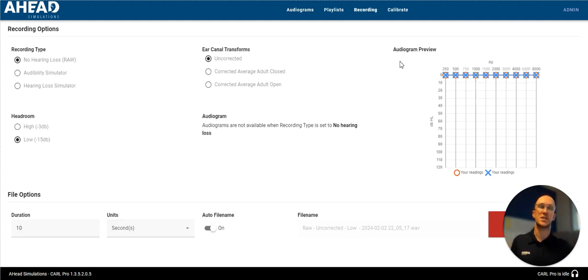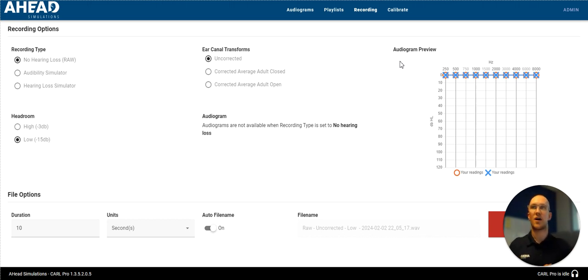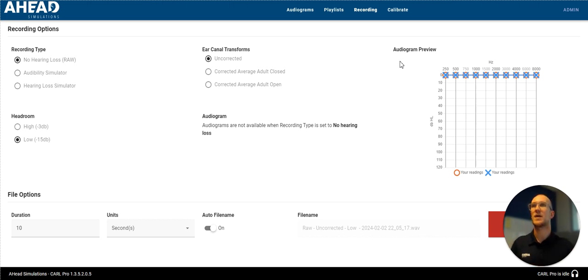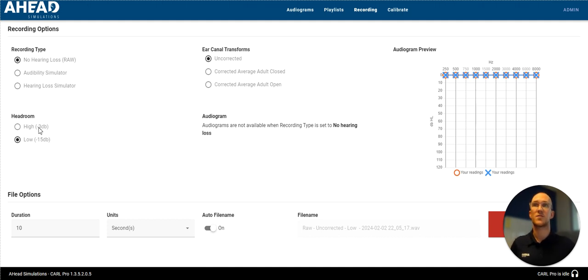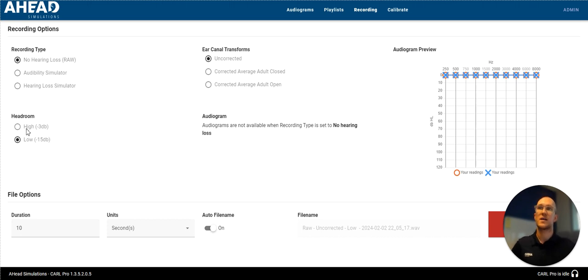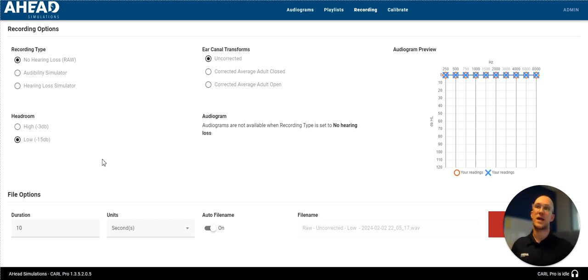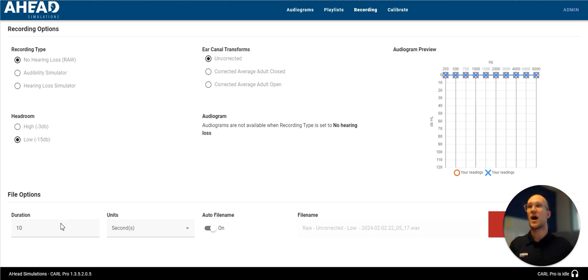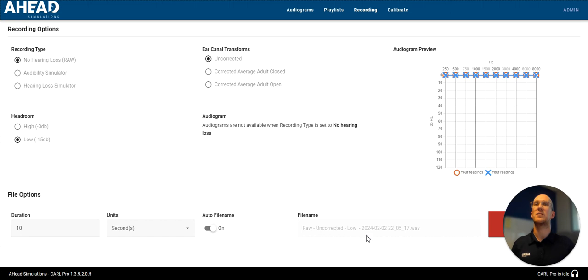So a whole bunch of options, which we'll have another video to talk about. But in this case, I'm going to do something very simple. I'm going to stick with no hearing loss for Carl. I'm not going to apply any ear canal transforms. And I'm going to keep a low headroom because I'm not playing any loud noises. It's just me talking right now. I'm going to record for 10 seconds. And I don't care too much about the file name.